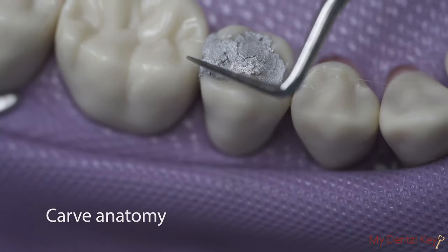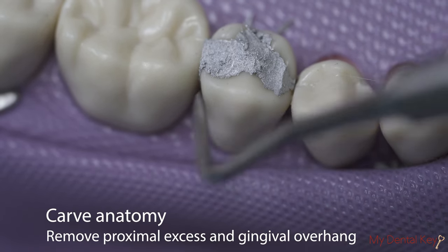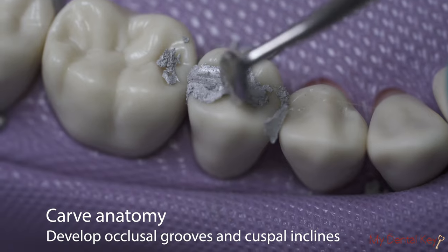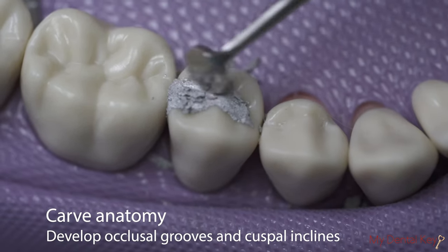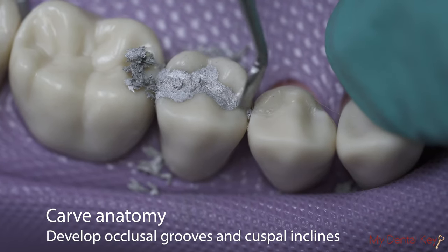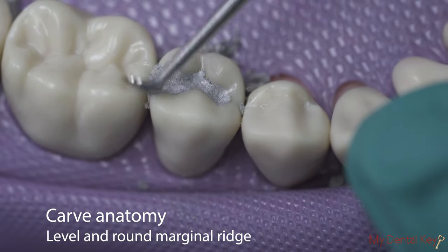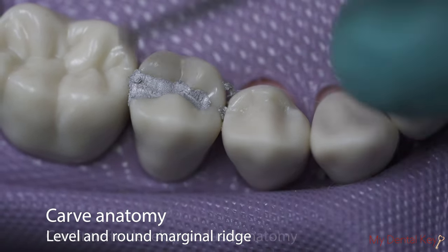Now, carve anatomy into the restoration. Remove excess amalgam from the proximal aspect and any overhang at the gingival margin. Develop occlusal anatomy by guiding your instrument along the remaining tooth structure to create developmental grooves and correct cuspal inclines. Instrument options include your acorn burnisher, cleoid discoid, or hollenback carver. Ensure that the marginal ridge is rounded and the height of the marginal ridge is consistent with that of the adjacent tooth.